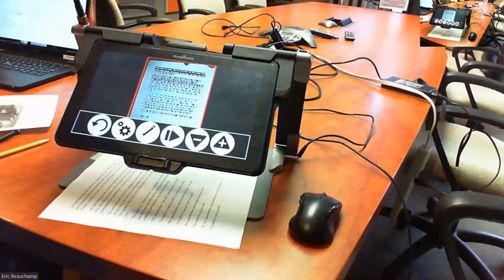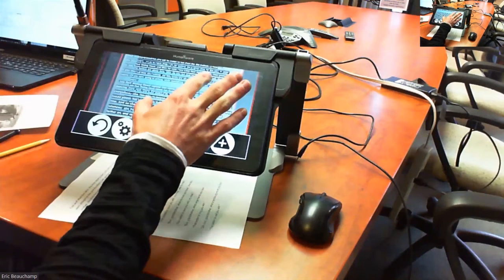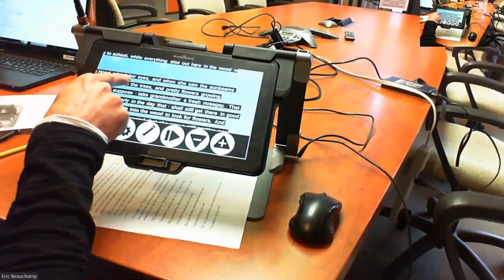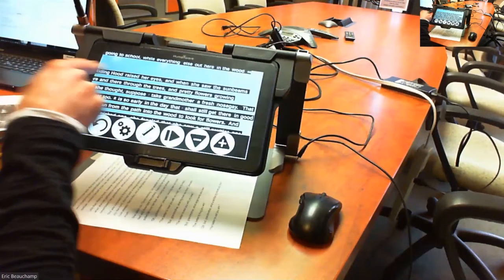Unfortunately, there's nothing really that can be done at this time, but in the future versions that we're working on is the ability of changing the results of the OCR. I don't have a date for that release, but what we're working on is that, let's say the word raise here is spelt wrong.